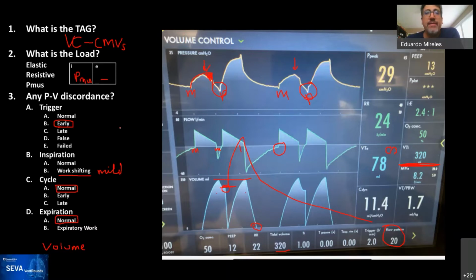It's 2:52. I don't think we're going to have time to do the next case, but any questions or comments so far? What did you do for this patient? How did you fix it? That's a great question. So I'll open it to how do you deal with early triggering? I'm looking at the chat, or if anybody wants to unmute. What's your number one behavior?